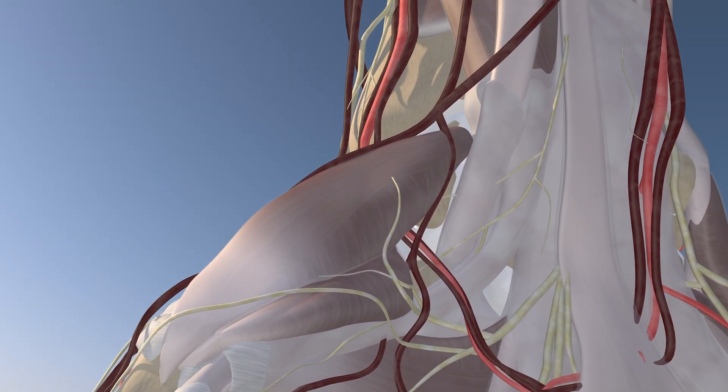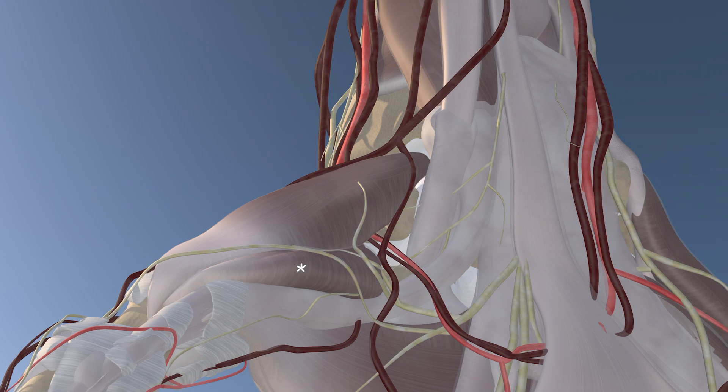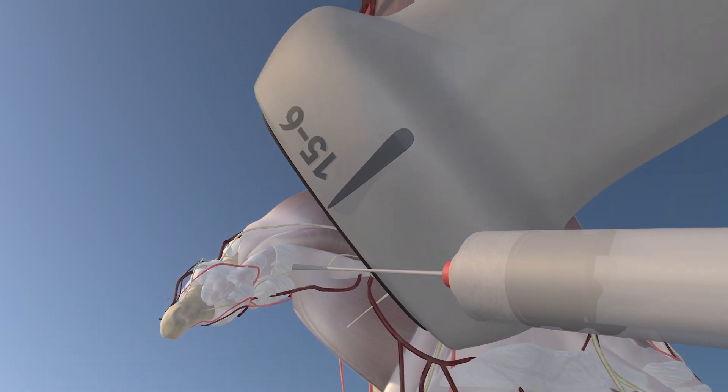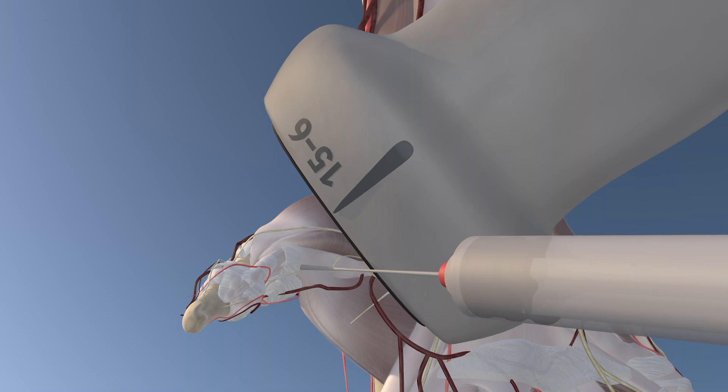Here we're rotating. You can appreciate the flexor pollicis brevis muscle and abductor pollicis brevis muscle. Here's our approach — we're right over the MCP joint, over the A1 pulley. And here we're proceeding with the injection.